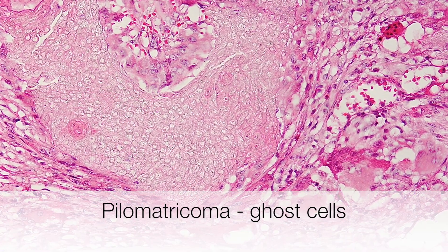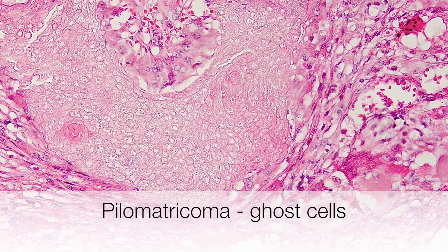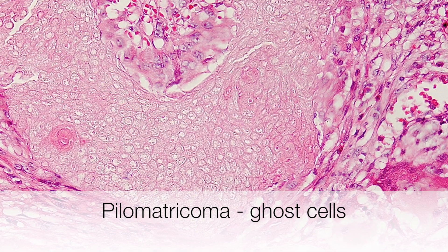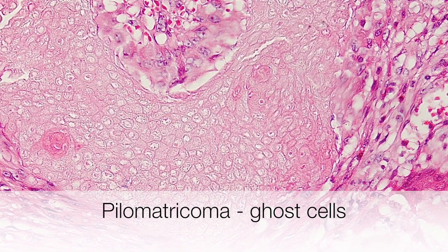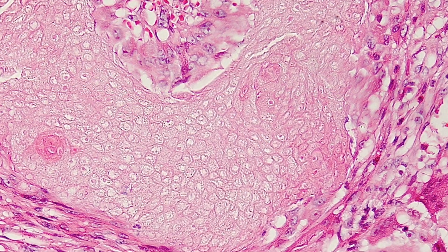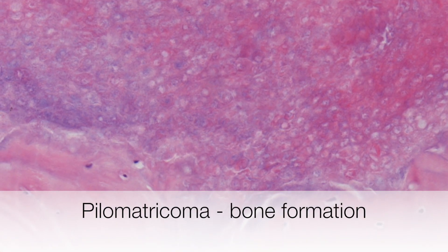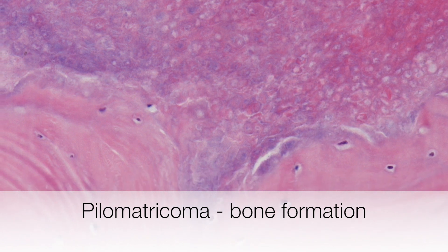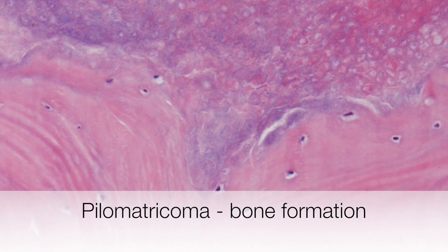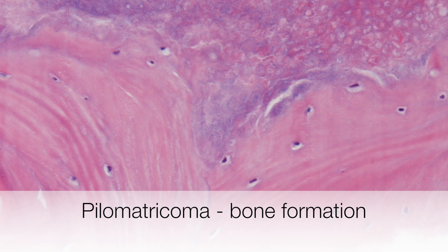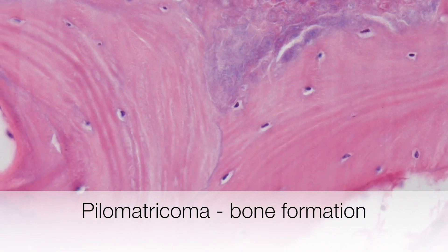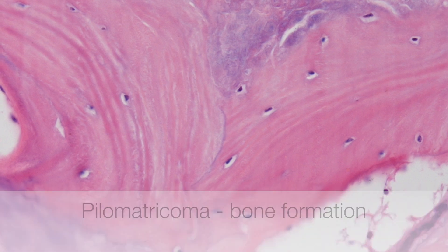This is a nice example of a sheet of ghost cells; the individual ghost cells are very well defined. At the top of the picture there are ghost cells that are starting to calcify, and the calcification has become so organised that it is now forming bone as we move to the bottom of the picture. You can see this is lamellar bone.